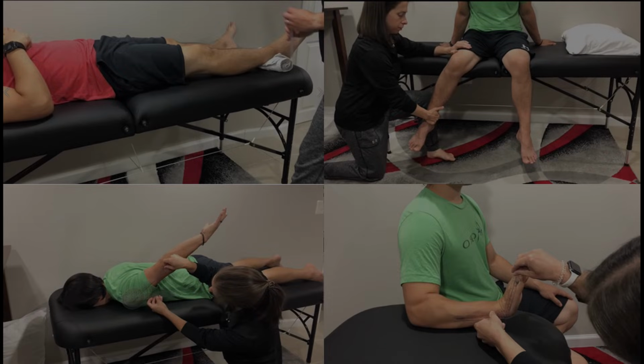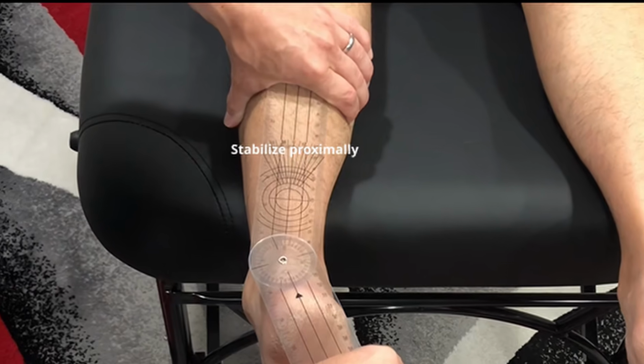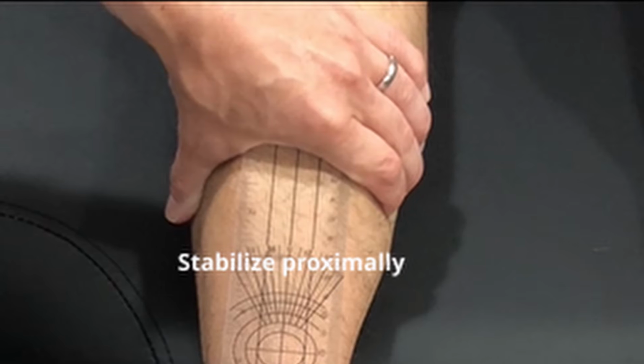Using consistent, well-defined testing positions is a key component of providing accuracy across time or between clinicians. In addition, properly stabilizing the proximal segment ensures that we have range of motion measurements that don't include unwanted contributions.